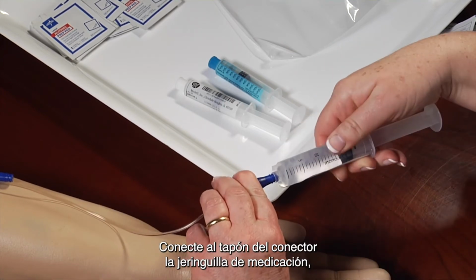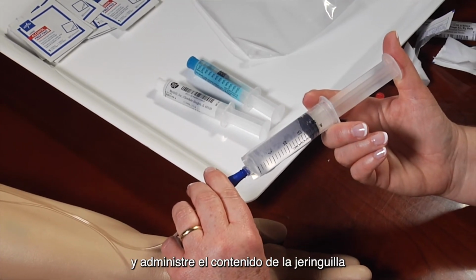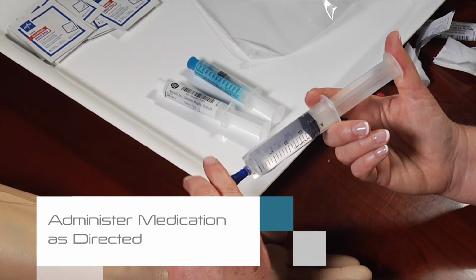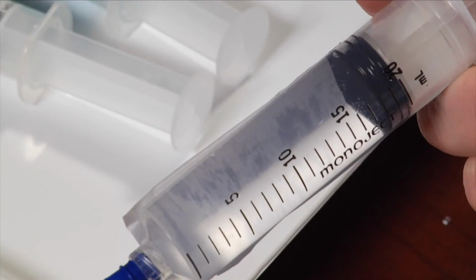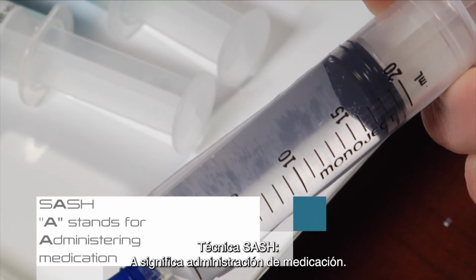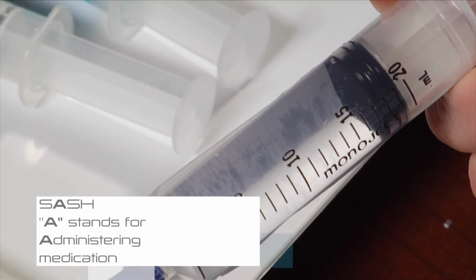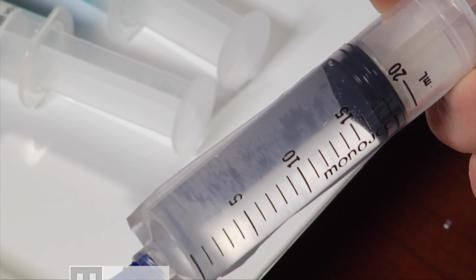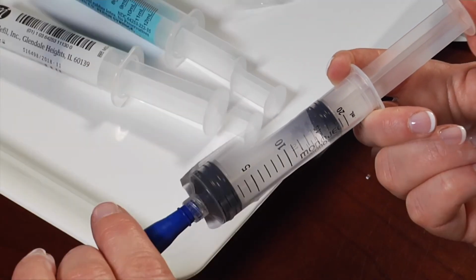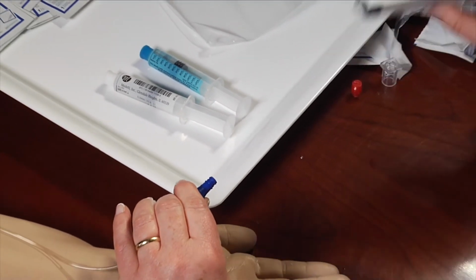Attach the medication syringe, either an antibiotic or your prescribed medication, to your injection cap, and administer the contents of the syringe as directed according to your Chartwell Plan of Treatment. SASH method. A stands for administering medication. When the contents of the syringe are empty, disconnect the syringe.